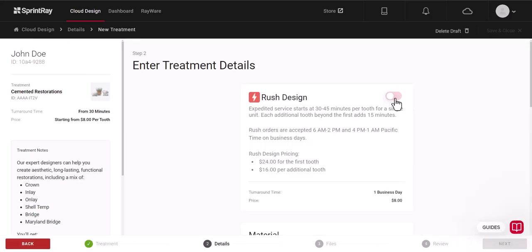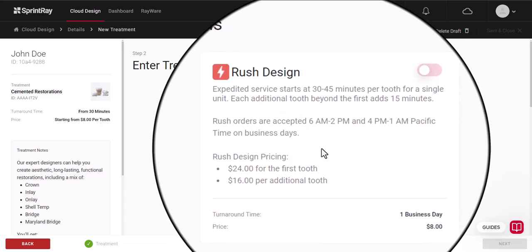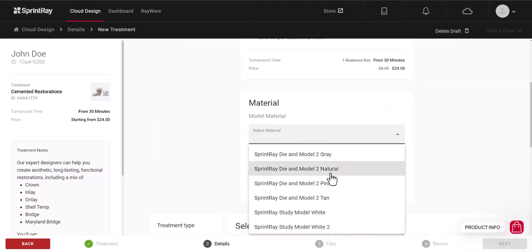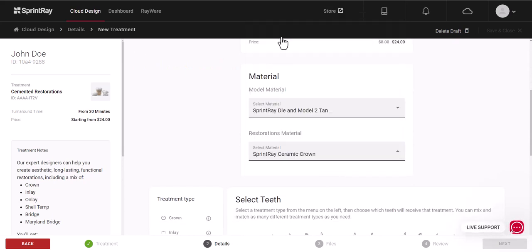Indicate if you would like Rush Design Service for a turnaround time of 45 minutes or less for an additional fee. Then select the materials for your cemented restoration and corresponding verification model.